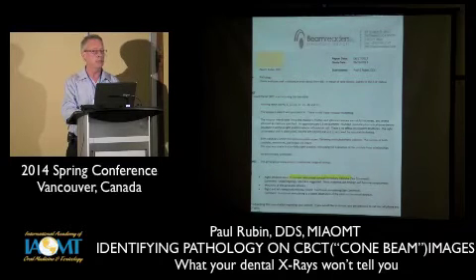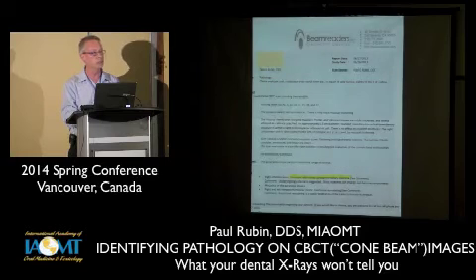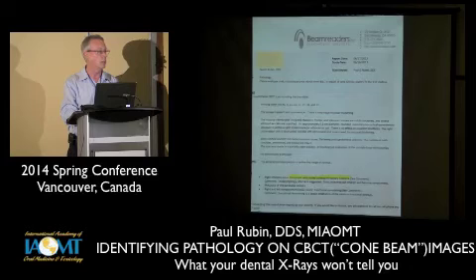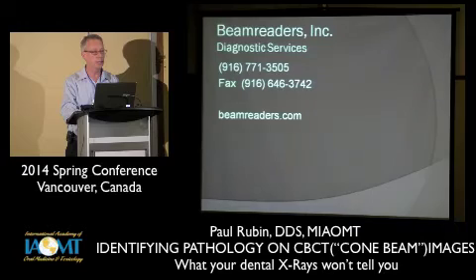So now you've got something where you've got a diagnosis of what this piece is. Now you can refer this off to an ENT along with this report, along with the images, and you've done your patient a service because you saw something that would never have been seen before. It might be perfectly innocent on this patient, but it's good to know that it's there. Here's information on Beam Readers, and again, you'll have that in your notes.